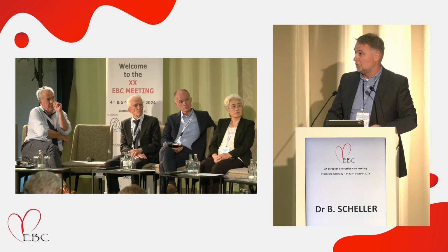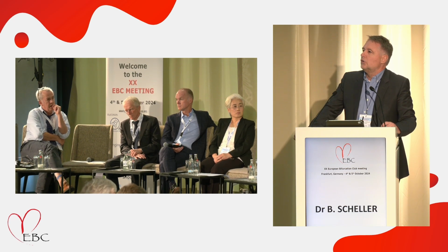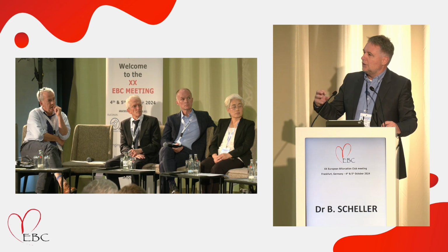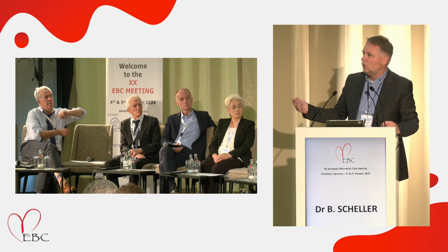Bruno, perhaps you could explain to us what you think is the mechanism of the plaque regression when you use DCBs? What's actually happening that influences that? So we know from experimental data that paclitaxel has some anti-inflammatory effect in the plaque, and this may contribute to some change in the structure and maybe, at the end of the day, a reduction in volume.